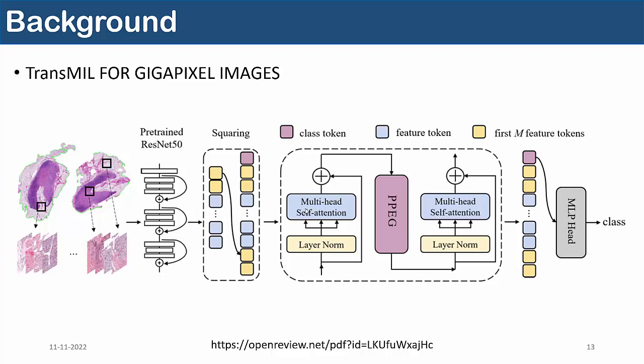The standard self-attention mechanism requires the calculation of the similarity scores between each pair of tokens that it receives. To deal with these long instance sequence problems in WSI, there is a Nystrom method that has been adopted for this particular implementation by the authors, and then it passes through the PPEG module, which uses different size convolutional kernels in the same layer, which can encode the positional information with different granularity, enabling high adaptability of PPEG.